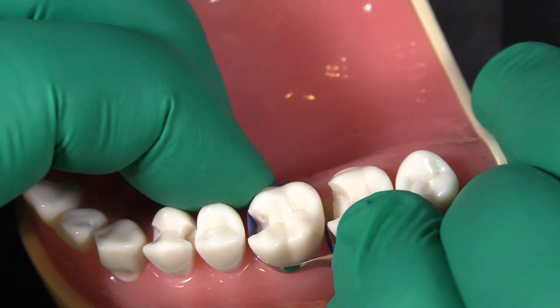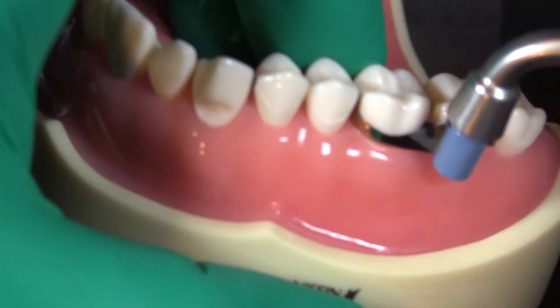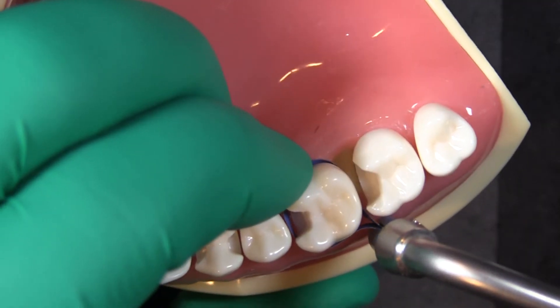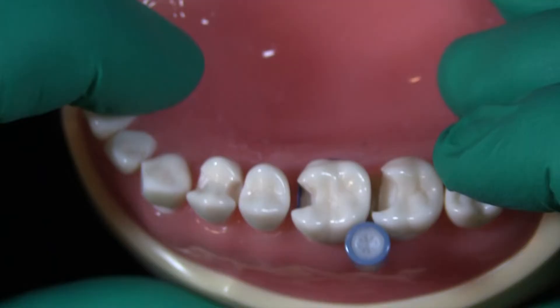What I'll do is put pressure to hold that in place right here, then clamp that down. Then I'm going to start to tighten this up and release. Now that's nice and snug.